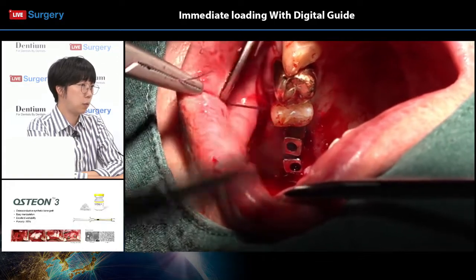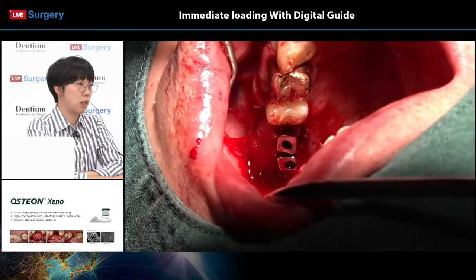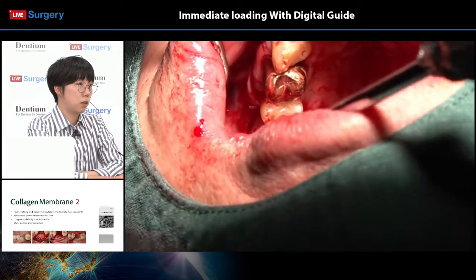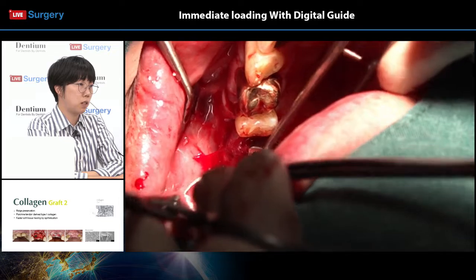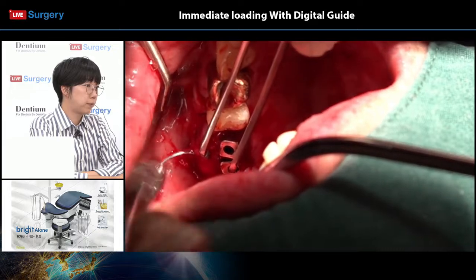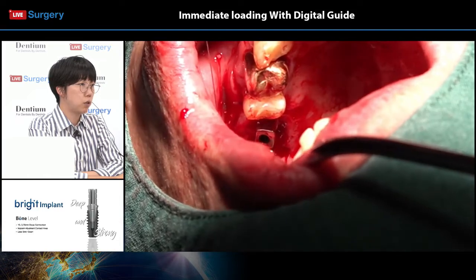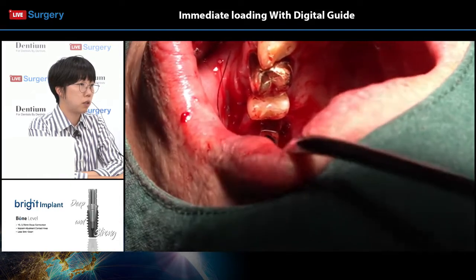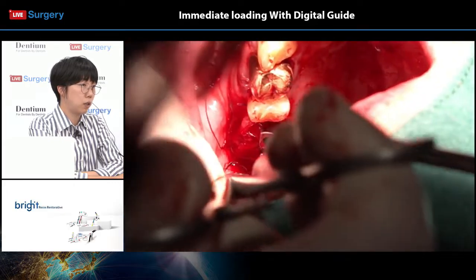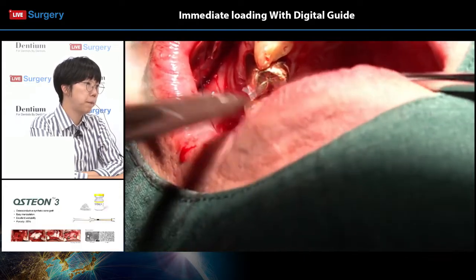You can see that tooth number 14 is shaking because of the periodontitis I have mentioned before in the case summary. So an extraction on that area would be necessary in the future. And he is doing interrupted sutures on the upper right area. A suture going along between the abutments.